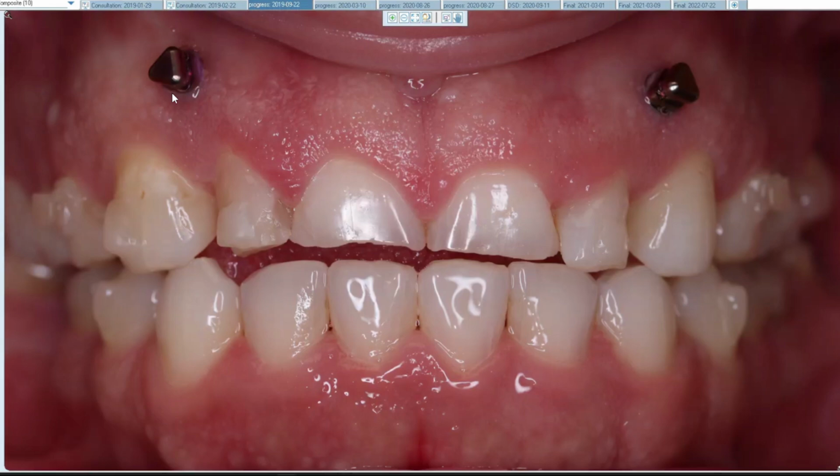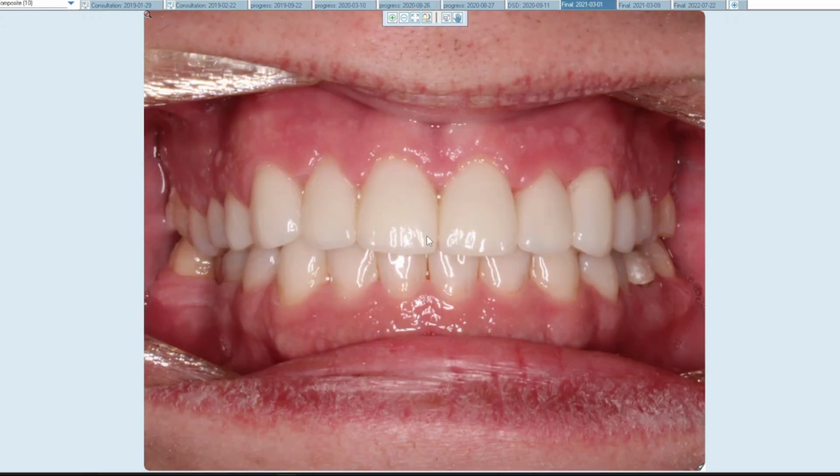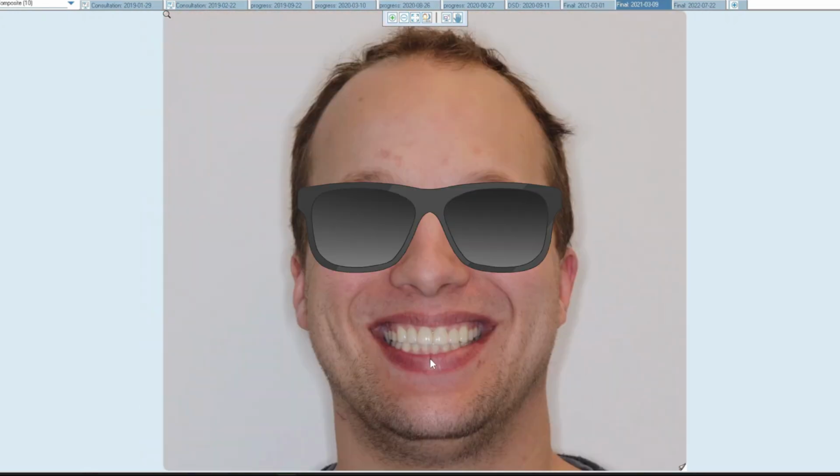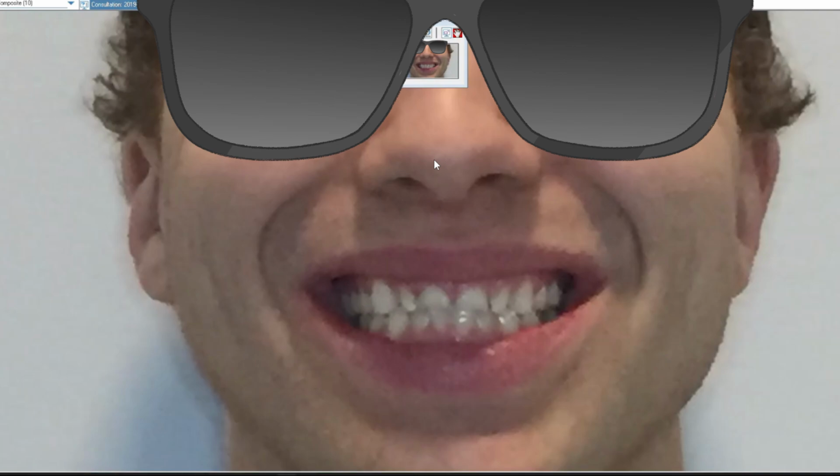Nothing too crazy. So I'll go ahead and show her the reason why we had to do the TAD in this case: we needed to intrude these front teeth. So we use the Invisalign aligners and we use elastics. We pull up on the teeth in order to level the gum lines. We're not actually covering this particular case, but this is what things look like after the crowns are done. At the end of treatment, this is what it looks like after the restorative, whereas this is what it was like after the orthodontic treatment. This is what it looked like at the very beginning of treatment.